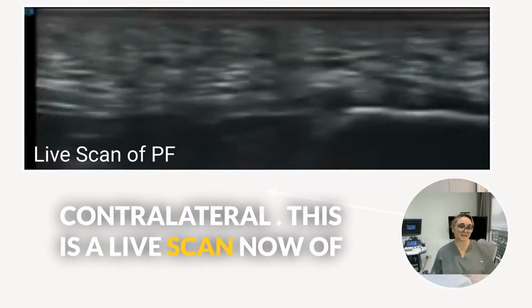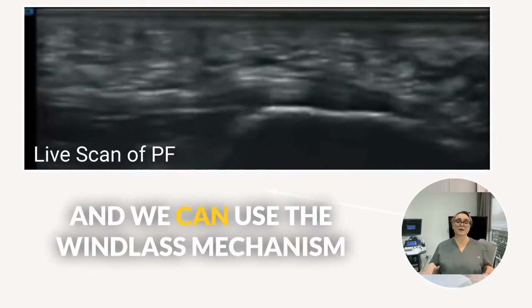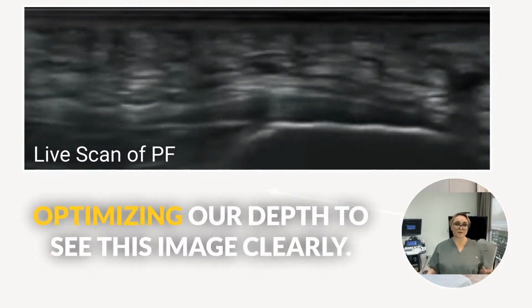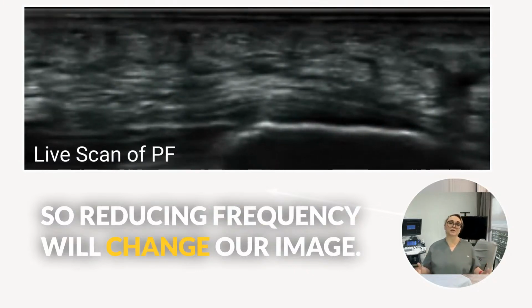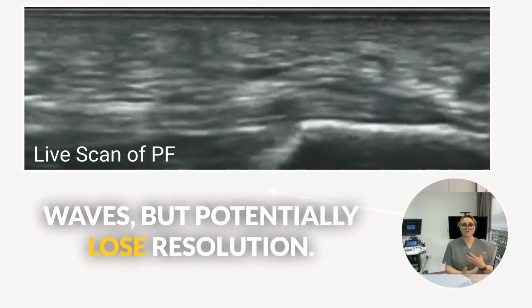This is a live scan now of the plantar fascia. We can see the calcaneus nicely, and we can use the windlass mechanism to ensure that we're on the right structure, optimizing our depth to see this image clearly, and then thinking about changing our frequency. So reducing frequency will change our image, enable greater penetration of sound waves, but potentially lose resolution.